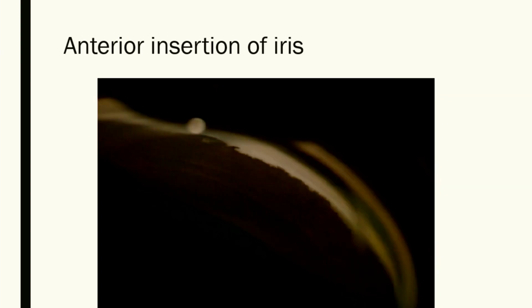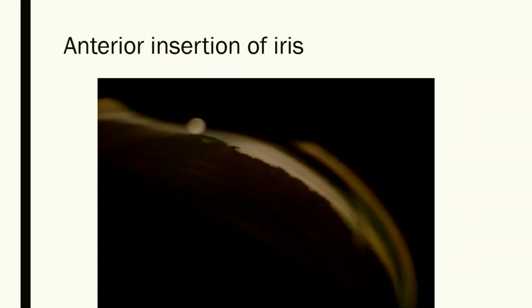It all indicates a juvenile angle. Yes. Anterior insertion. Why do you say anterior insertion? How do you know anterior insertion from, say, circumferential closure? Both, you can't see the angle much. One, the age group. They may be younger. Second, if you see lots of iris processes, they are not smooth like the PAS. Third, you'll have a flat iris contour with the iris rising up to the angle like that if it's anterior insertion. Whereas in PAS, you'll see the angle convex, and then you'll have one localized area where the iris is lifted up and it will go beyond the Schwalbe's line.